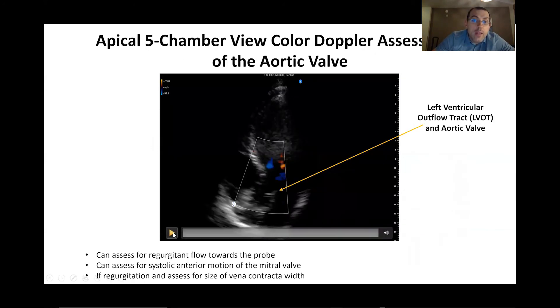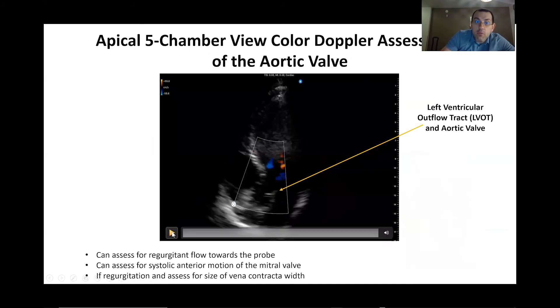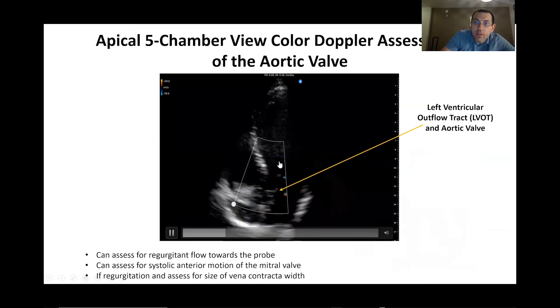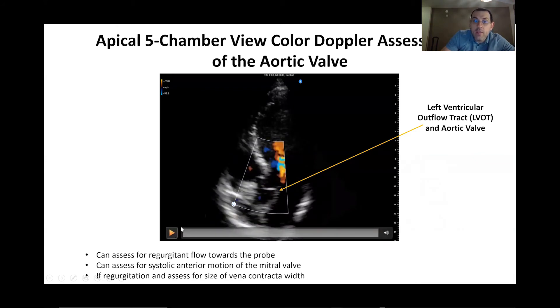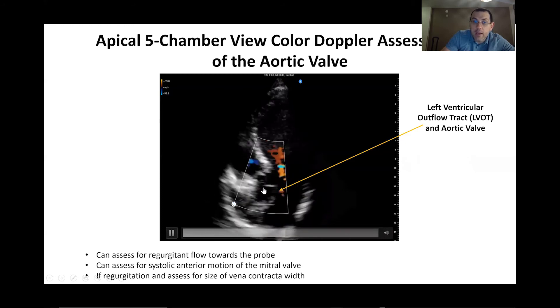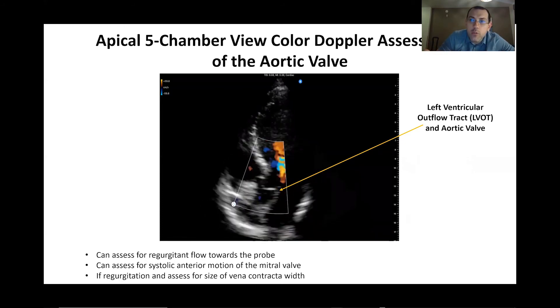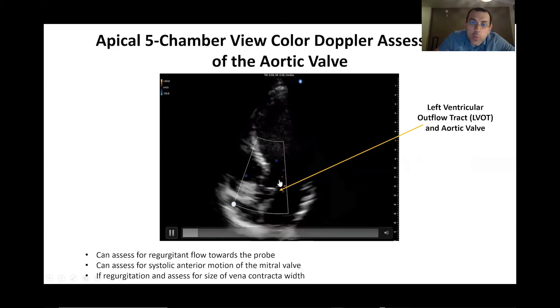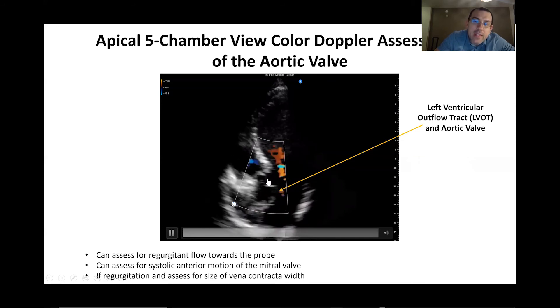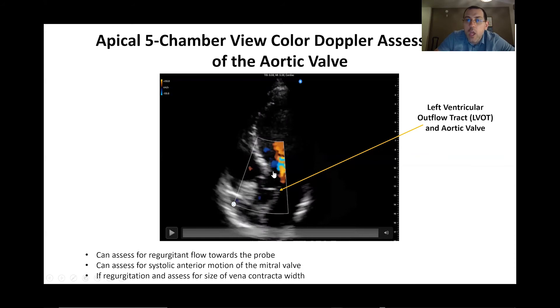By rocking the probe slightly from the apical four-chamber view, we can bring the aortic valve into better view — this is now our five-chamber view. Here is the aortic valve and the left ventricular outflow tract. We look for the same parameters: any regurgitation with flow going back towards the probe after ejection, and a vena contracta. We can also assess for obstruction of the left ventricular outflow tract by the anterior leaflet — we call that systolic anterior motion, or SAM for short.